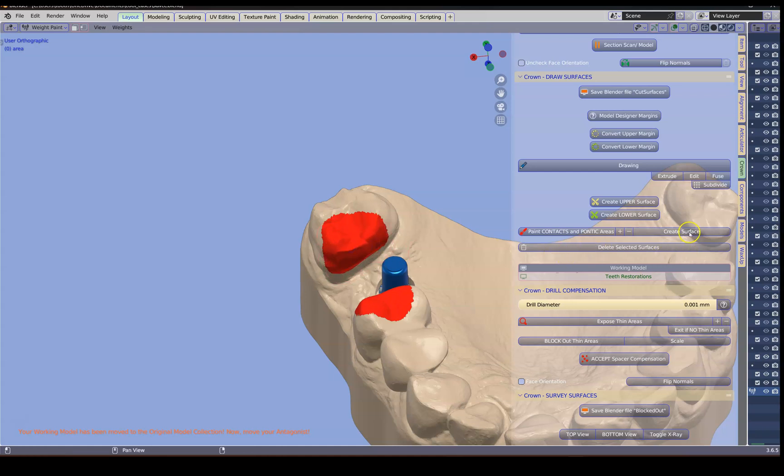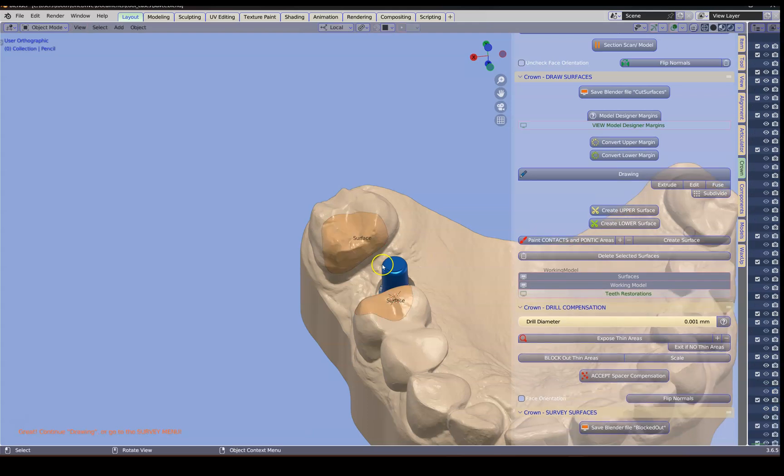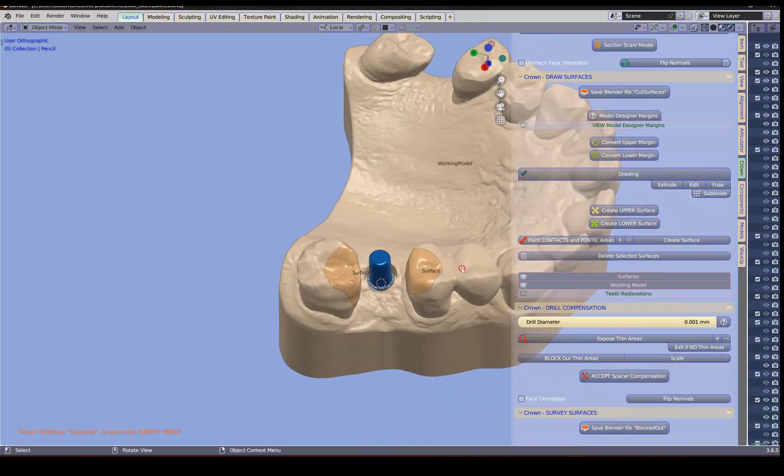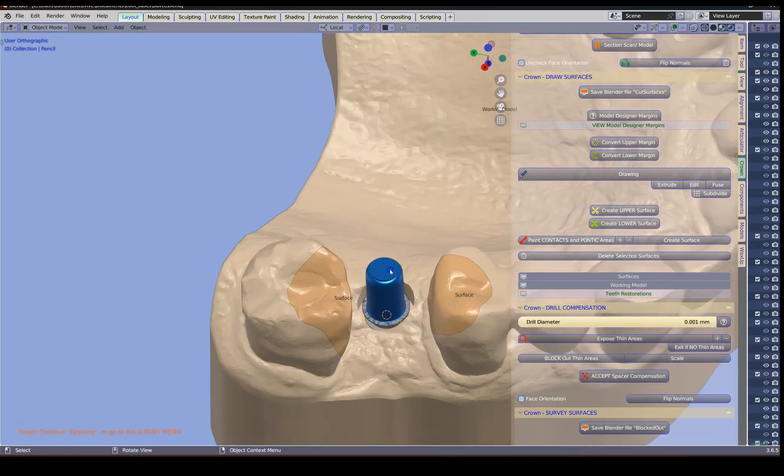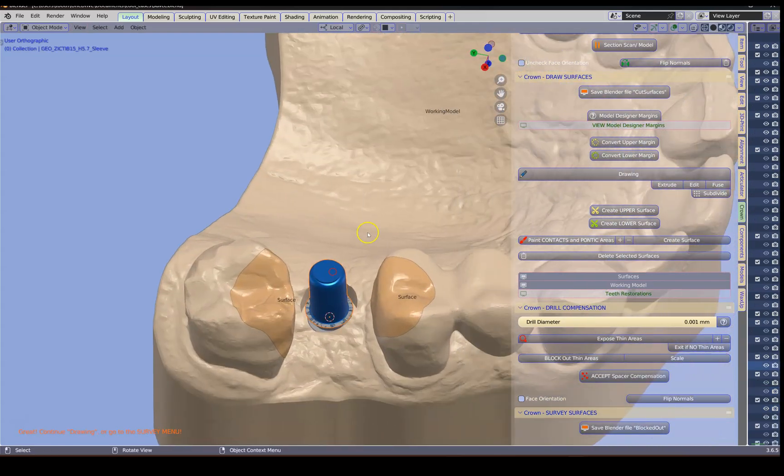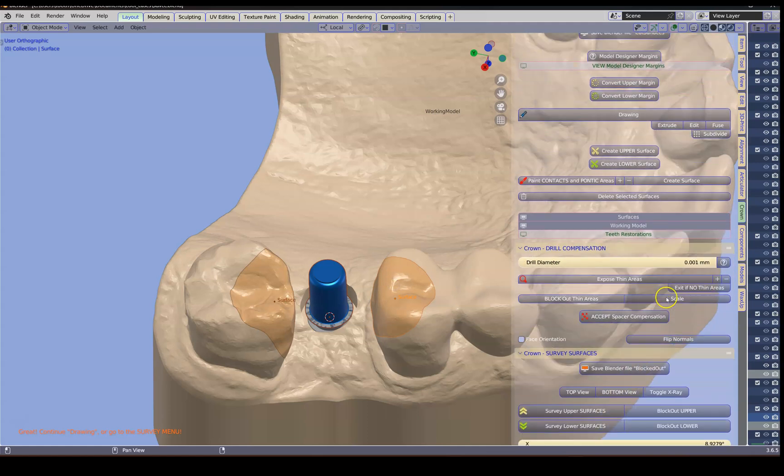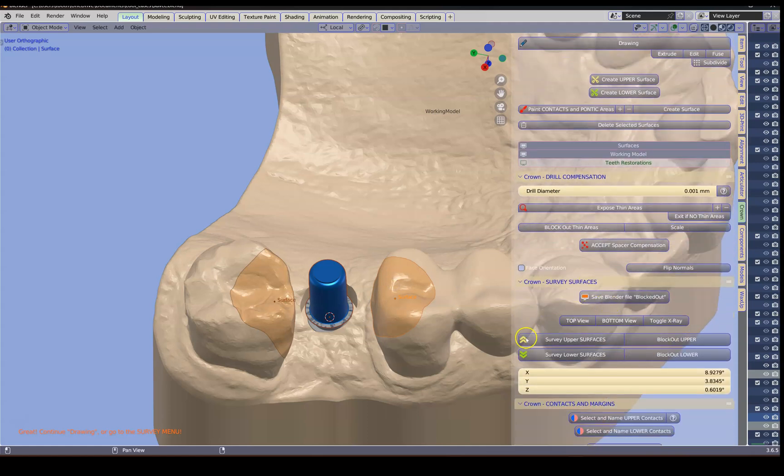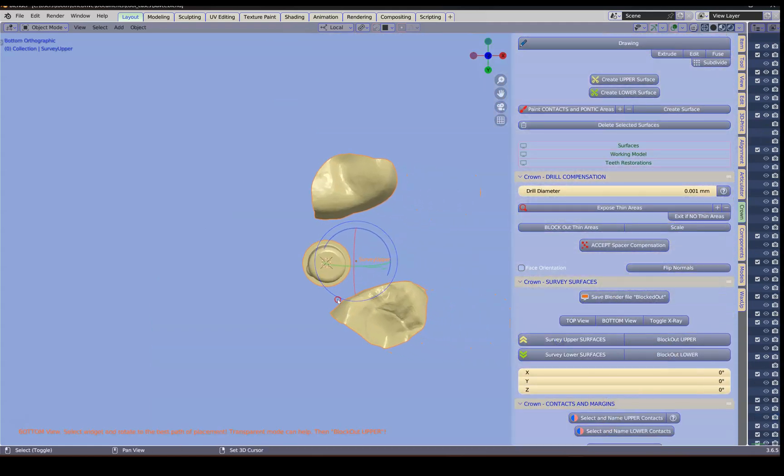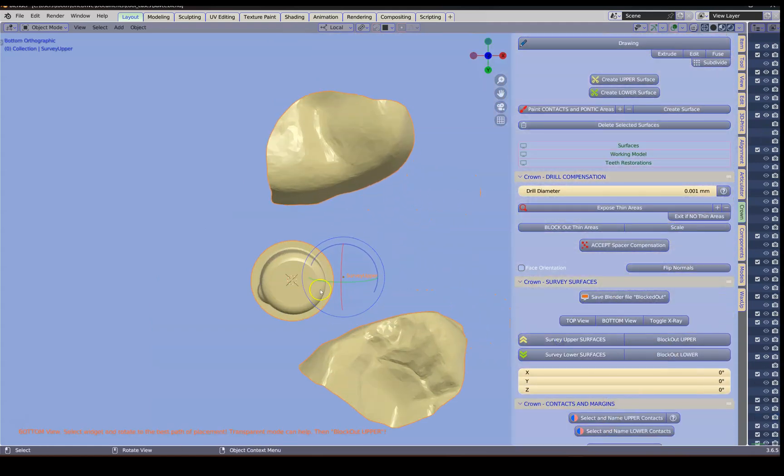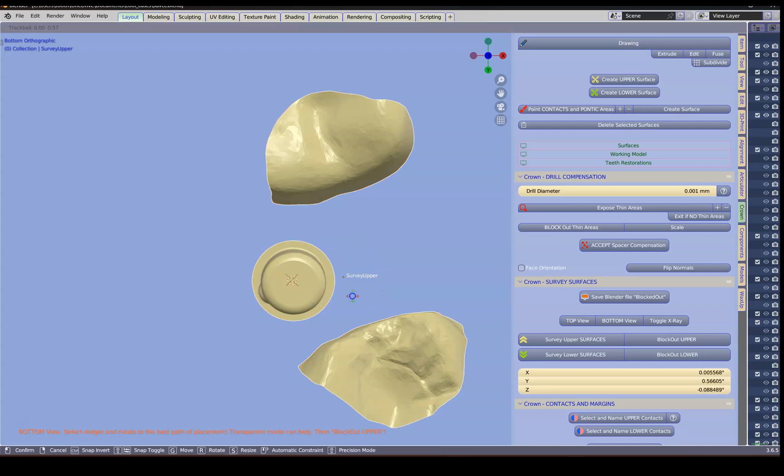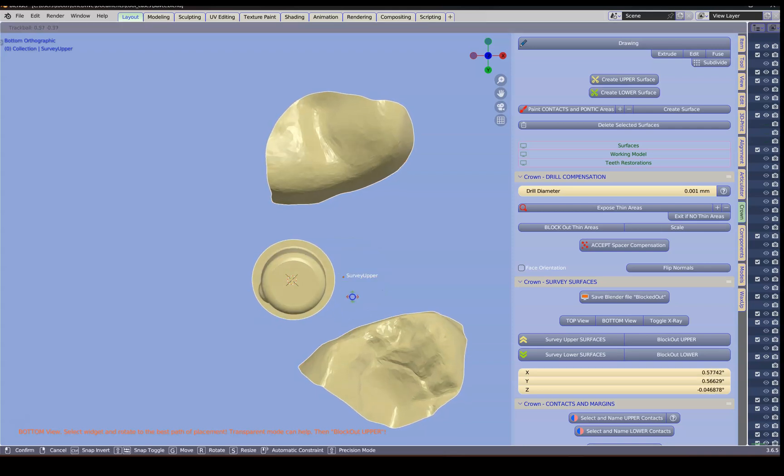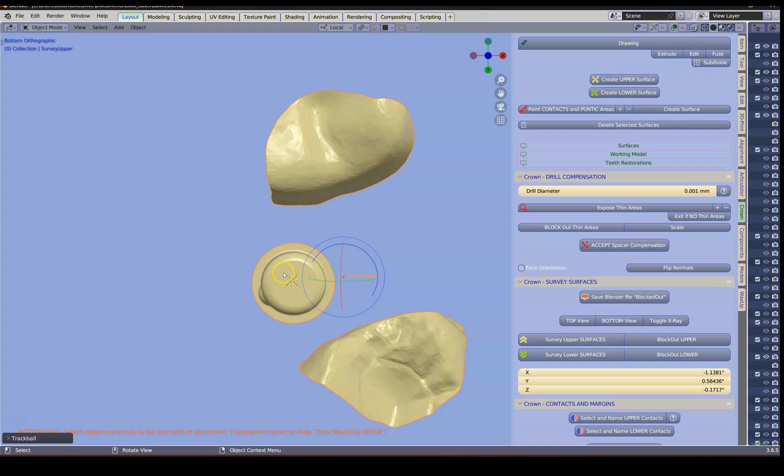We're going to create these surfaces. We're going to duplicate this one. This is a procedure we take. Shift D to duplicate. Select. And we're going to then survey these surfaces. And this is because we want to get a straight path of insertion with this cap. This interface. And then block it out.